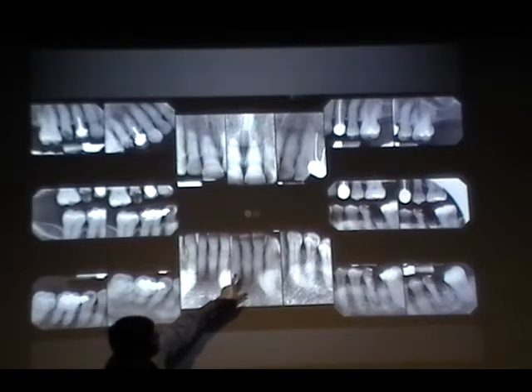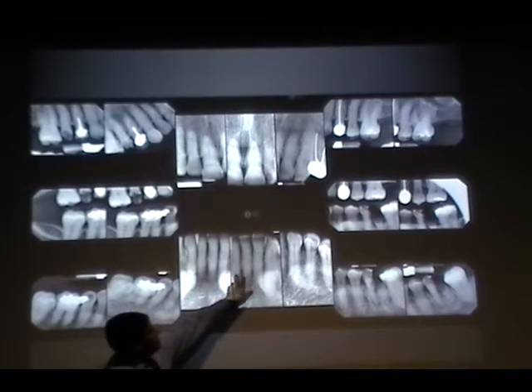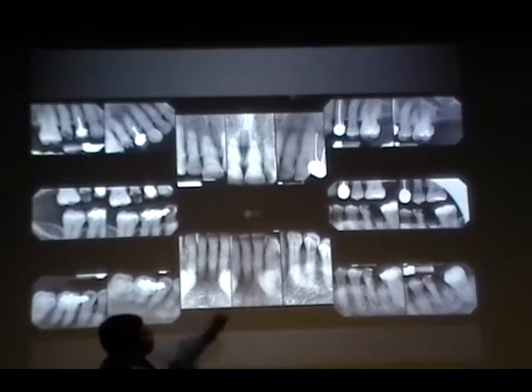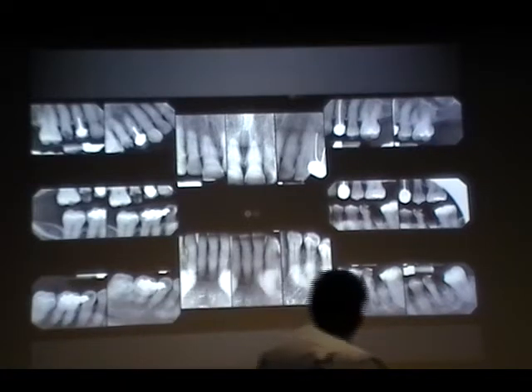So can you help me to understand, when you say open contact, which tooth are you referring to? The central incisors. These two? This is lateral and this is canine, right? Mm-hmm. What if the patient has malocclusion? Like in this case. Oh, I gave you the answer. Okay, so the patient has malocclusion in this case, so that's why you're not able to open the contacts. Okay. You should be centered on the.